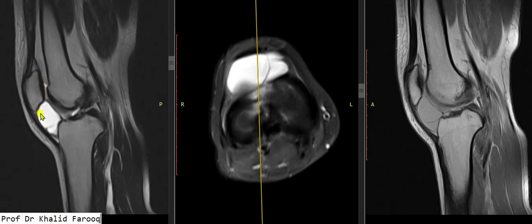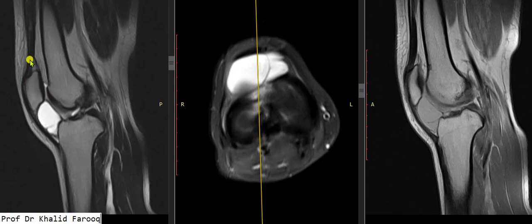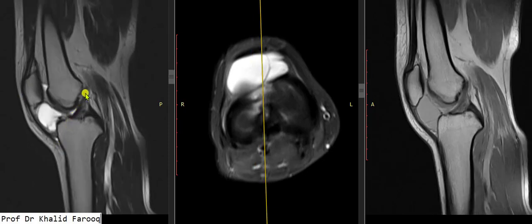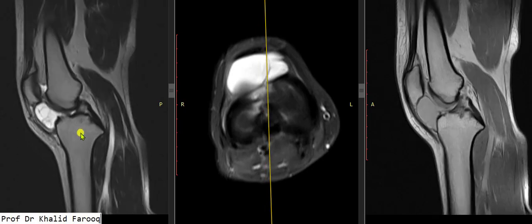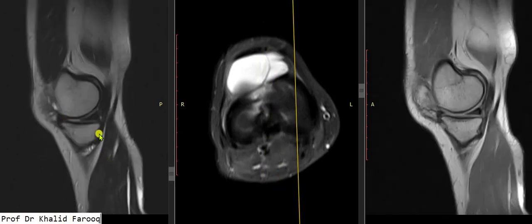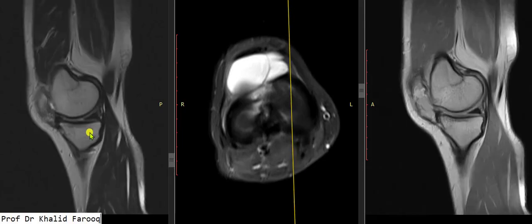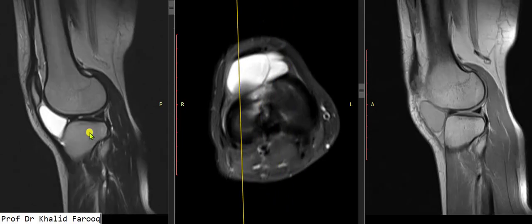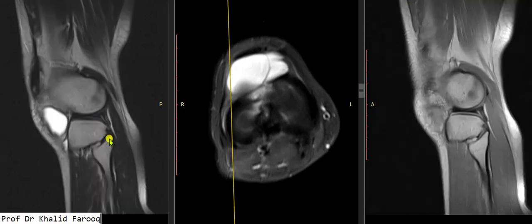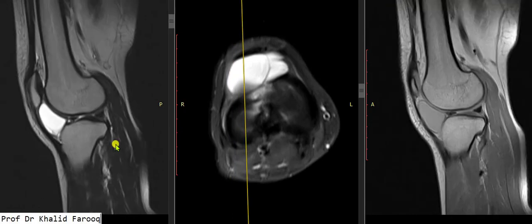The retropatellar cartilage appears normal with a normal patella. Quadriceps and patellar tendons are normal, and we can see the ACL is normal with a normal PCL. The medial meniscus — anterior and posterior horns and body — is normal. Similarly, the lateral meniscus anterior and posterior horns including its body are all normal.